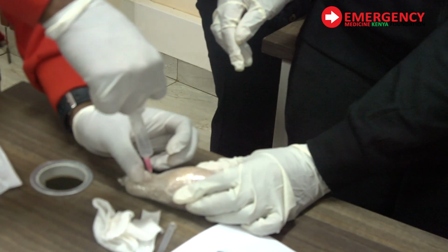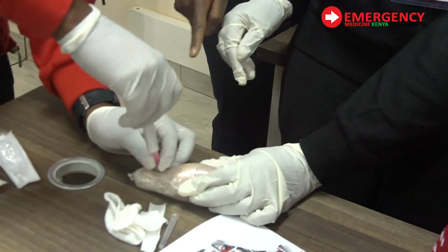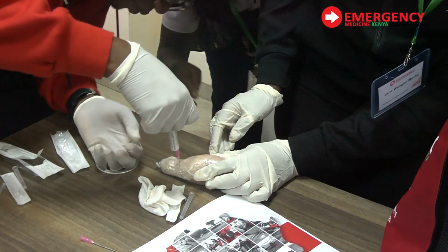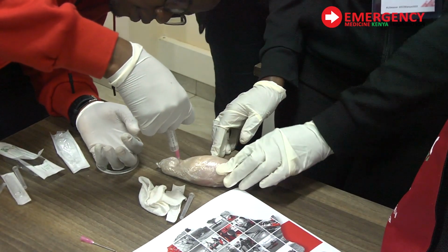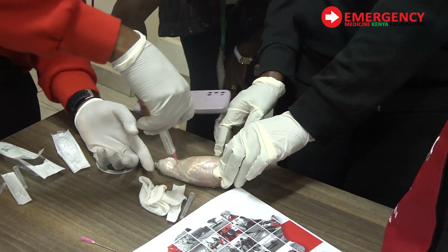So the risk of fat embolism is not that high. But if you leave it there for too long, it can clog and cause a fat embolism. That's why you are resuscitating with the aim of getting an IV access. Once you get an IV access, you remove it.